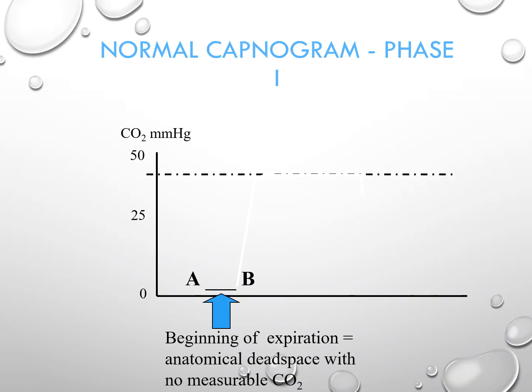Peeling away a few of the layers of the onion here, let's look at what constitutes this normal waveform and what the different phases are.